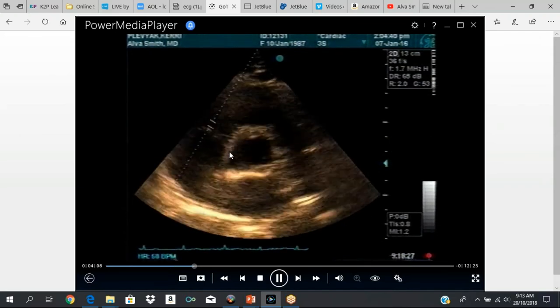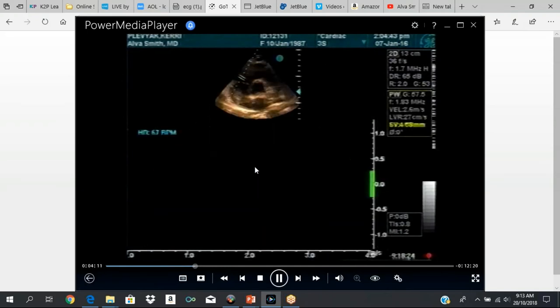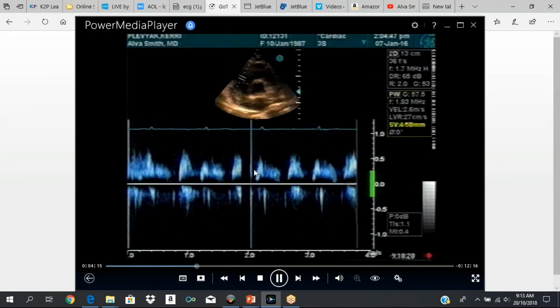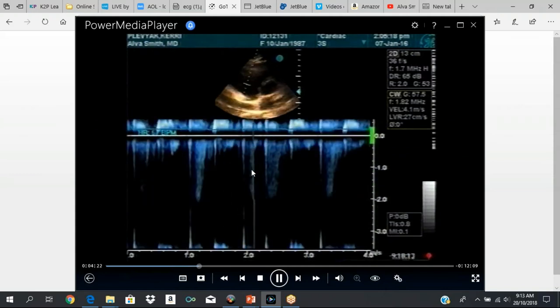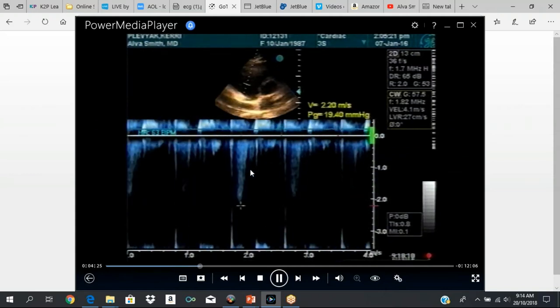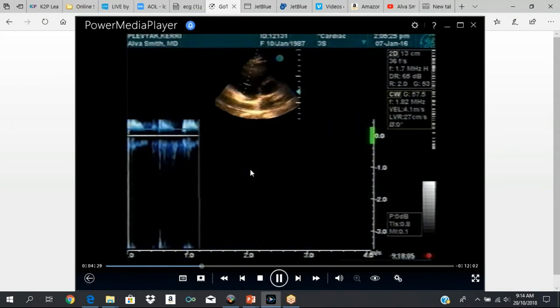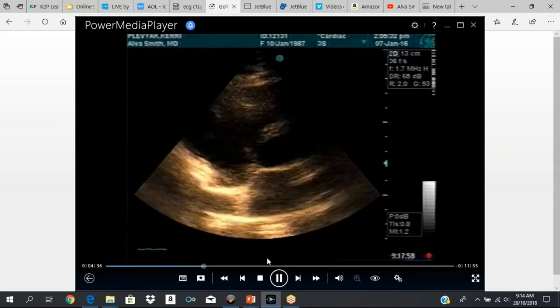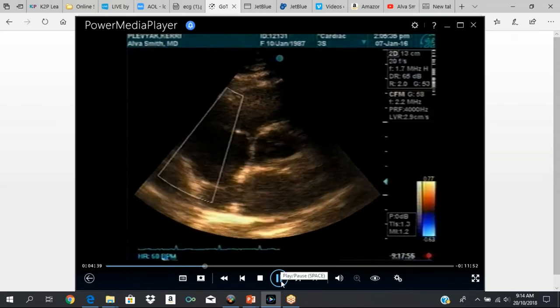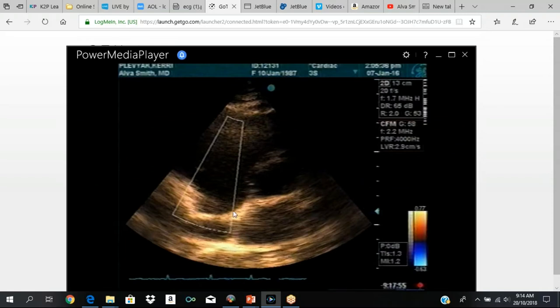Short axis at the level of the aorta — you can see there are three cusps, and you always have to identify all three cusps. The atrial septum is adjacent to the non-coronary cusp, and then you have the right and the left cusps. This is the atrial septum because this is the right atrium and this is the left atrium. Adjacent to the atrial septum is the non-coronary cusp, which is right there.